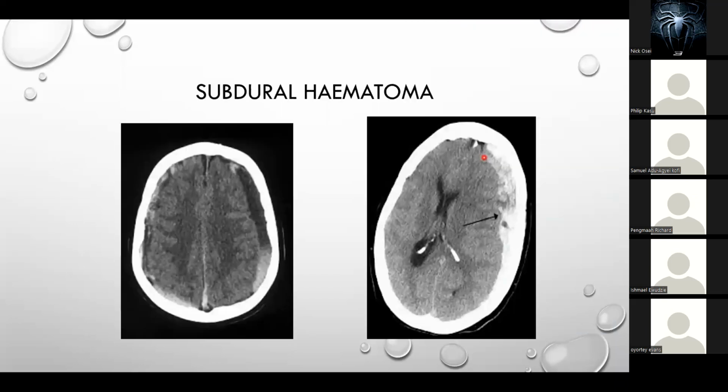Okay, so this is what I want you to take home. As I was saying earlier, in certain emergencies, when you do a head CT scan, for instance, you won't wait 24 hours for the report to come before you take action. So you should get familiar with how a normal head CT scan looks. Now, these are pathologies that I have here. I hope you'll be able to appreciate it.